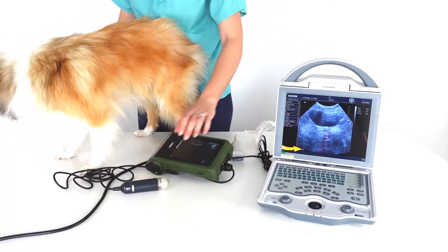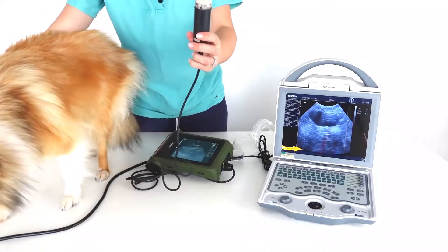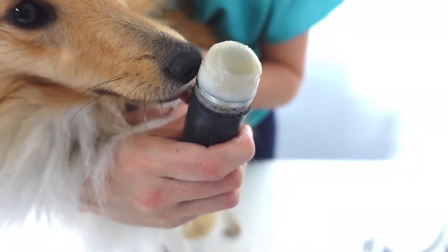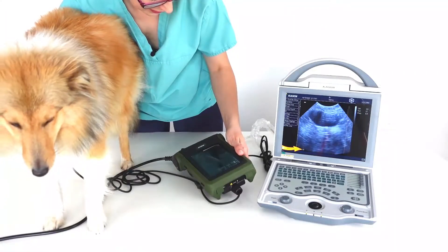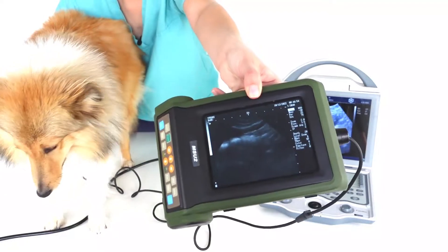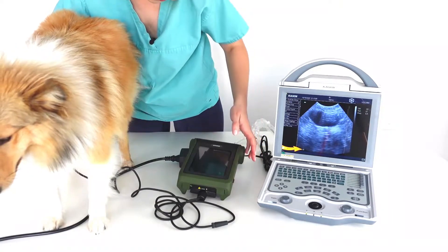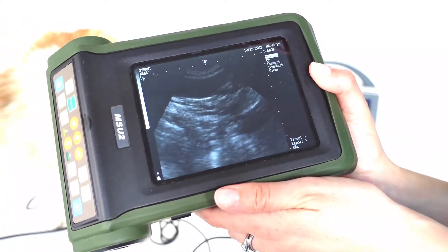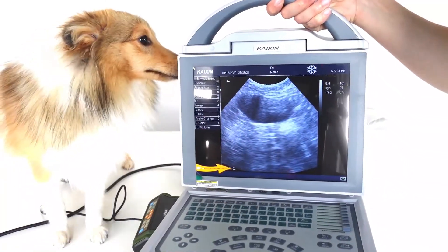Now we'll try on a mechanical sector scanner. The first thing you'll notice with this kind of machine is that as soon as it's unfrozen, it vibrates in your hand. There's one crystal and it's mechanically swung in a pool of oil. And there it is. I'll freeze that image again. Here's the bladder on the mechanical sector scanner, and here's the bladder on the electronic scanner.